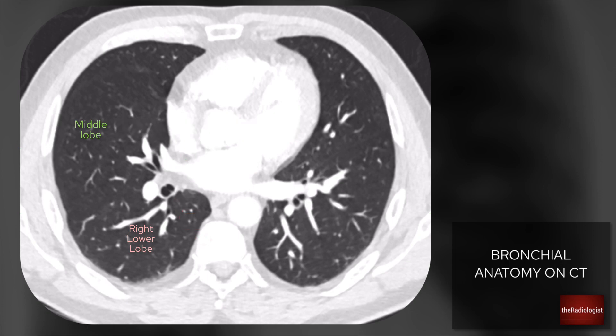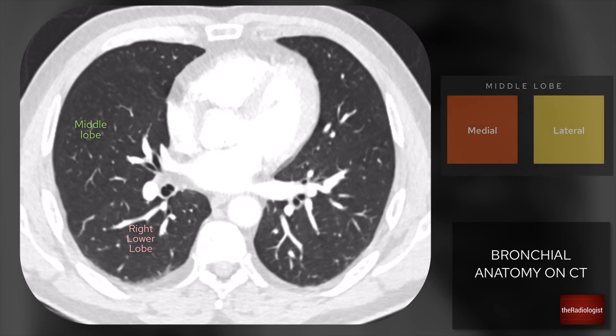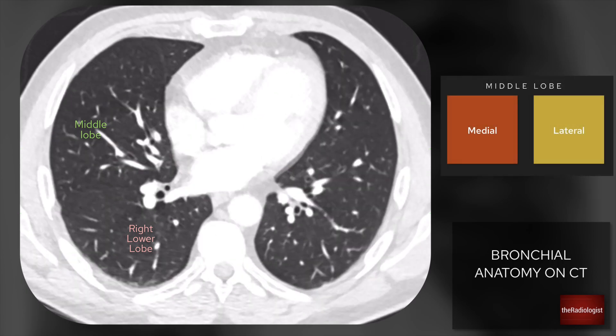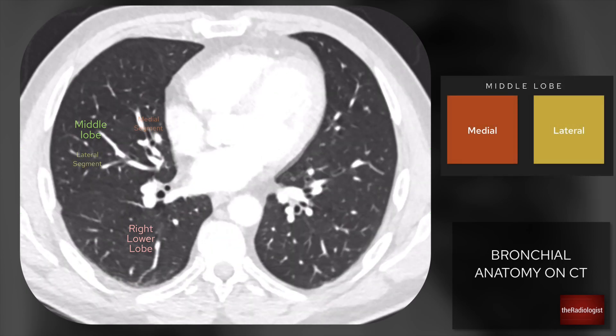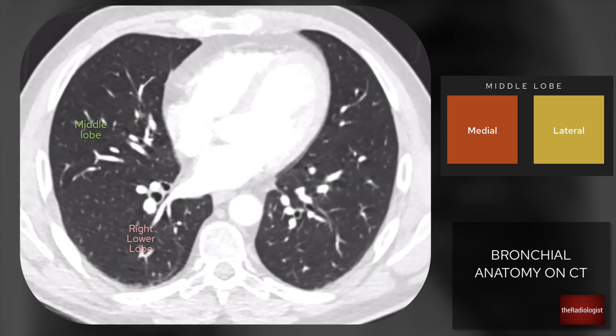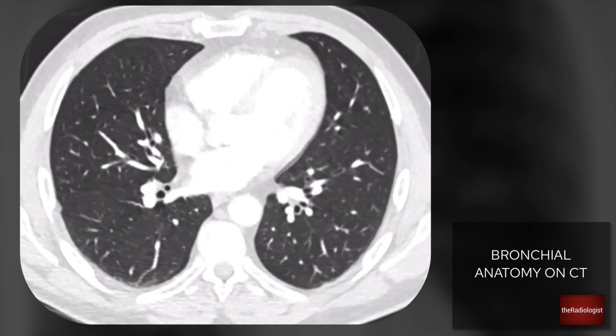The middle lobe, fairly easy to remember, has only two segments: the medial and the lateral. They sit side by side. The medial segment sits next to your right heart border. Remember on your chest x-ray, if you ever get the loss of silhouette sign, it's because you've got pathology within the medial segment of your middle lobe - that's the bit that sits next to your right heart border. So medial and lateral segments in your middle lobe.